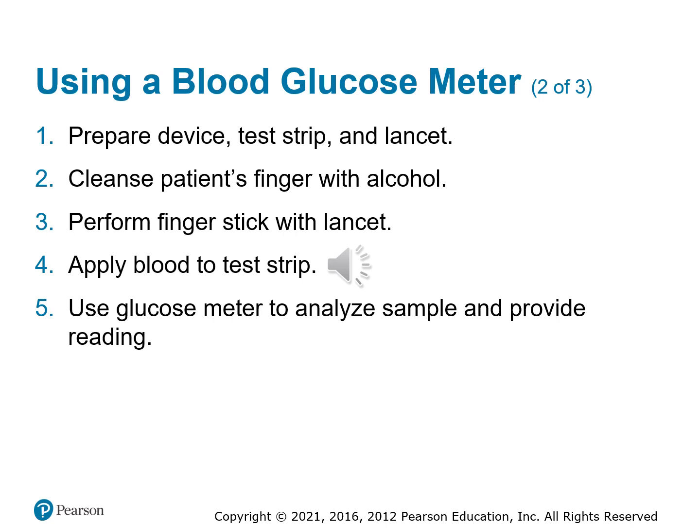So kind of repetitive here, but again, you're going to prepare that device. You're going to insert the test strip into the device, and you're going to have that lancet ready. You're going to clean the patient's finger with the alcohol prep. You're going to perform the finger stick.